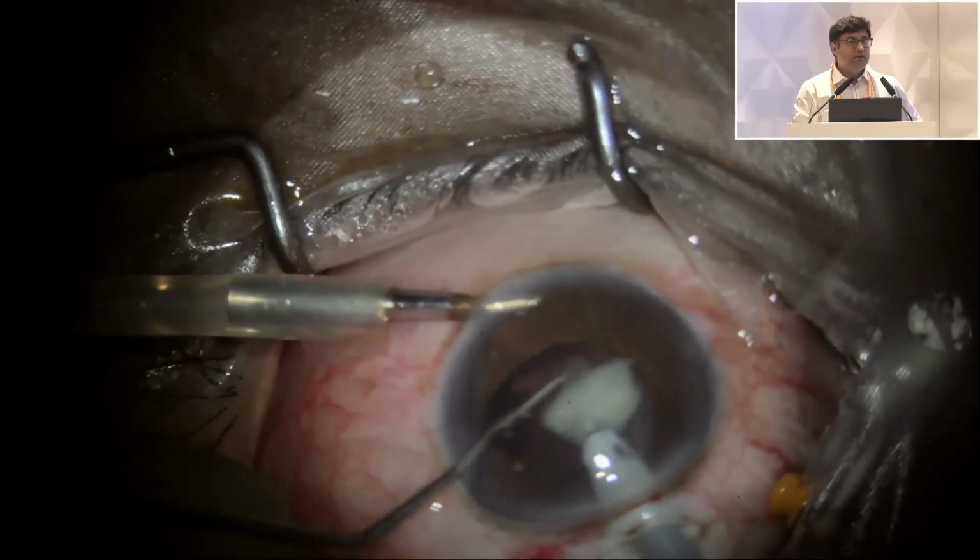So I put an iris claw there and I knew very well how to manage the nucleus, like what I did in the previous case. I took it away from the macula and impaled it so that there is no pressure on the macula from the nucleus, and exactly this is what I did. I took it out between the iris claw border and the pupillary border into the anterior chamber. There were a couple of small fragments of cortical matter that had got dislocated into the vitreous, but that you can easily manage with a cutter.